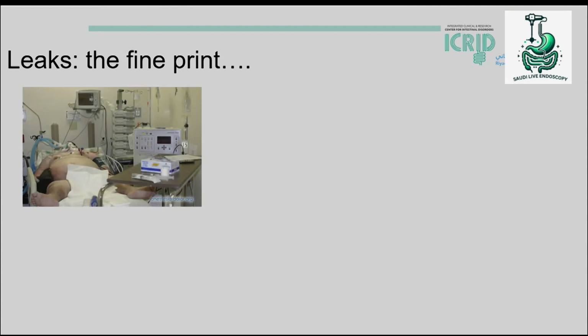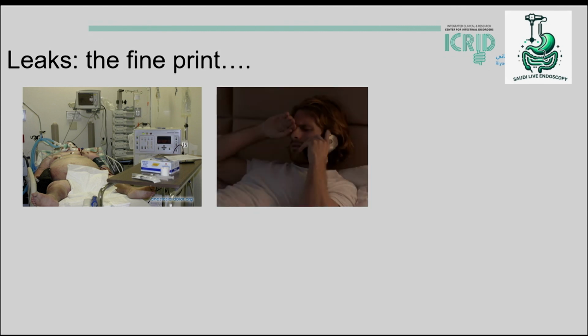Now for leaks, there is the fine print. I have to say this because many people come to conferences and they see these nice endoscopic pictures of before and after, and leaks have healed and so on. But this is not the reality. In the reality, this is the type of patient that you have when you first see, with all his comorbidities and difficult endoscopies, difficult position to work. And the patient, there is a chance that you will lose the patient. It's really a very stressful situation.